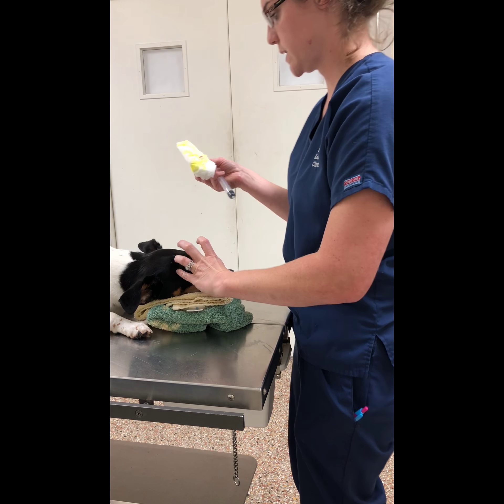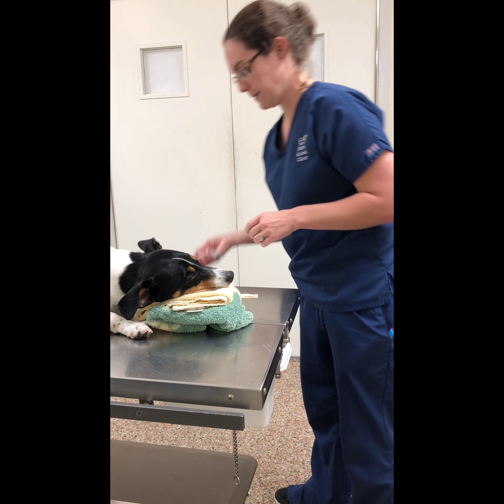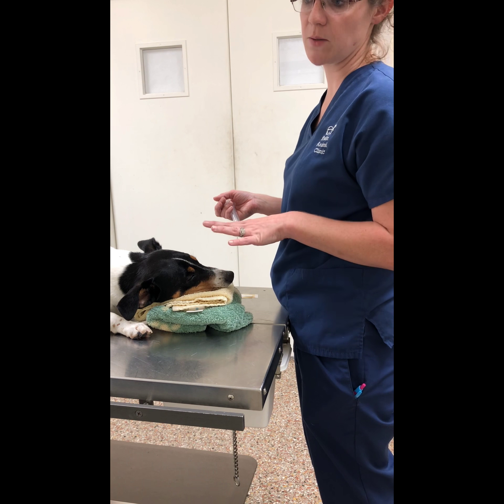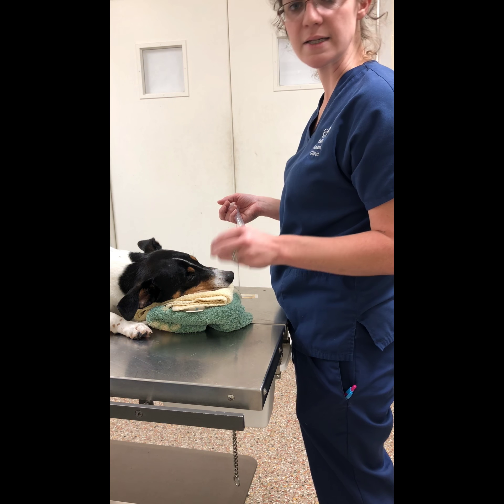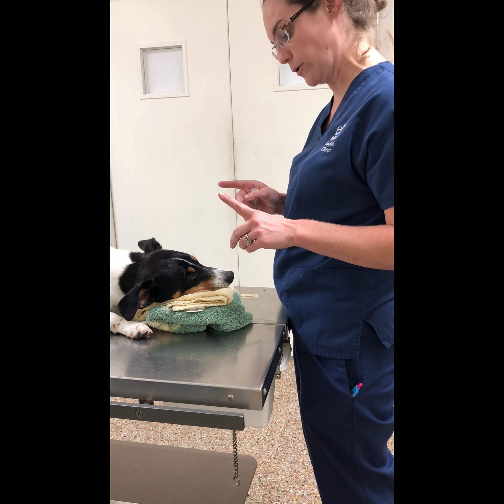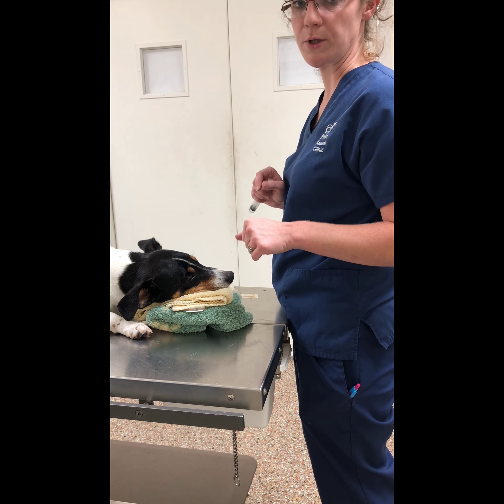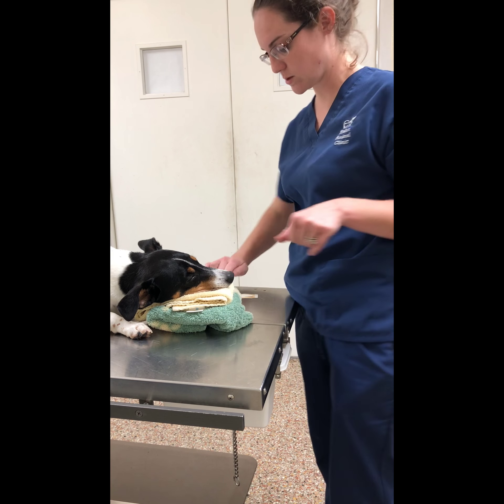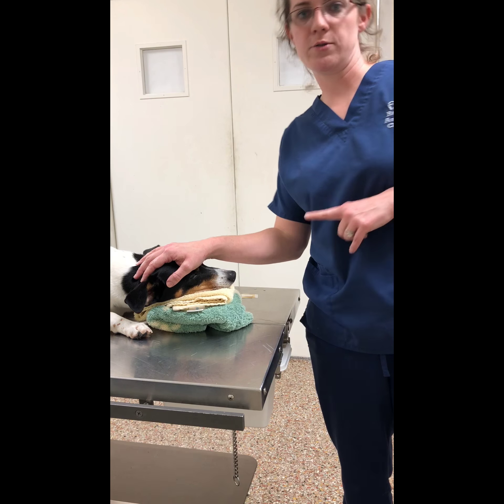That is a fluorescein staining test. I'm going to go ahead and do the exact same procedure on the other eye. Whenever we have any type of eye issue going on, even if there's only one eye that is having problems, we always go ahead and do both, just to check both eyes while we're doing it. Now I'm going to put it in his record.